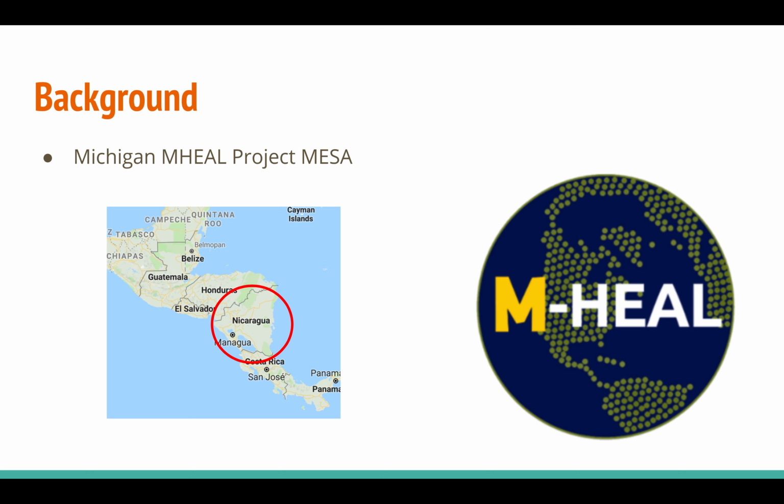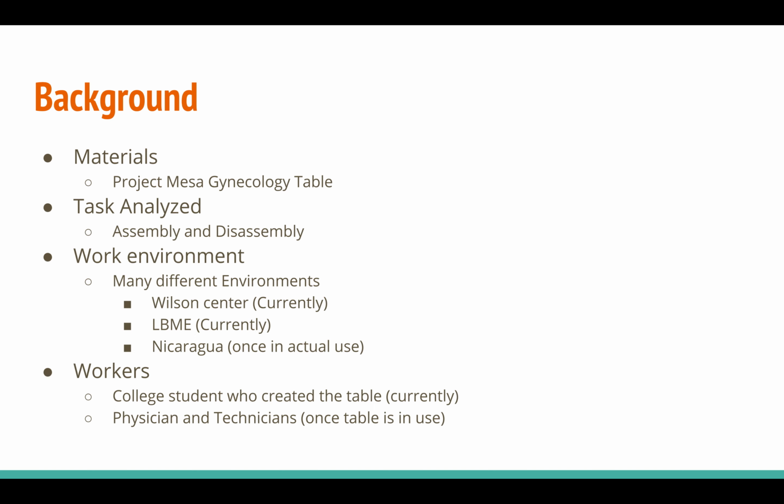A large priority of the team is to ensure that the table that we're providing is easily able to be set up and torn down so that the clinician can operate quickly. The optimization of this process is the goal of our project. We used our design table as the main material.